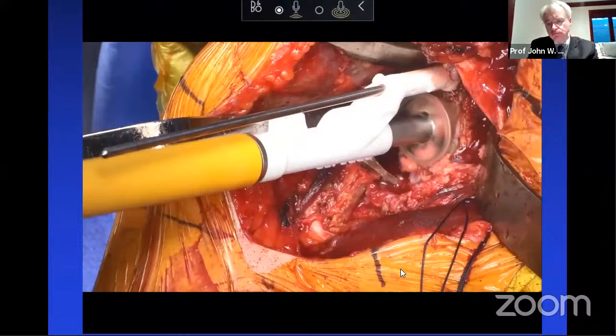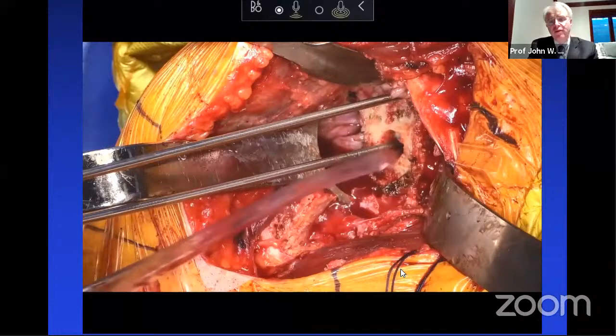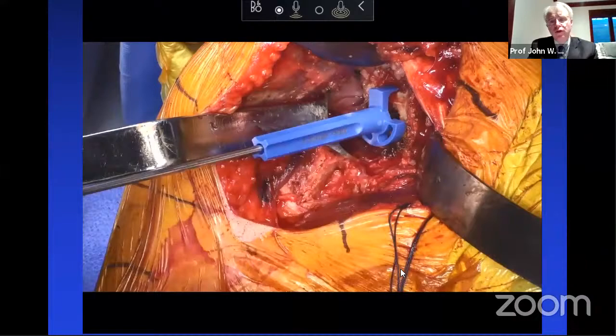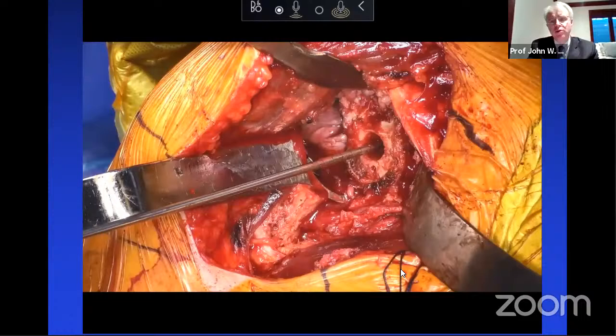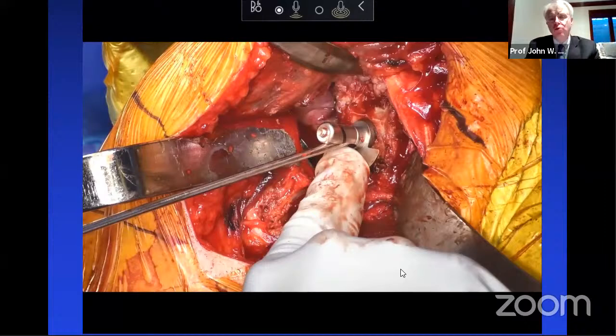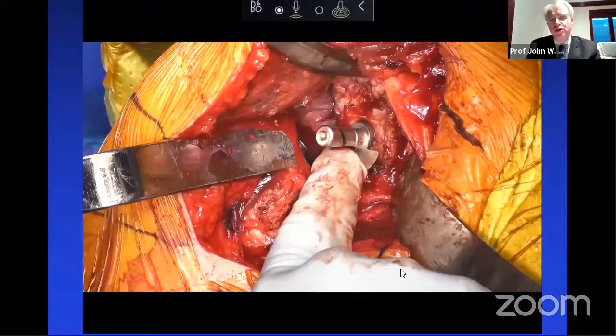And then we've already planned this case to be able to use a medium augment. So we have a little bit of bleeding bone in there on the bottom. We've preserved that nice hard cortical bone. We use a circular augment so I can dial in any orientation that I want. I've already planned the orientation. This is another interesting step where we can go ahead and prepare it and place in the same rotation. Another paper has come out and shown that if you have 5 degrees of malrotation of an augment, you lose over 50% contact. So we want to make sure we prepare it and place it in the precise way.